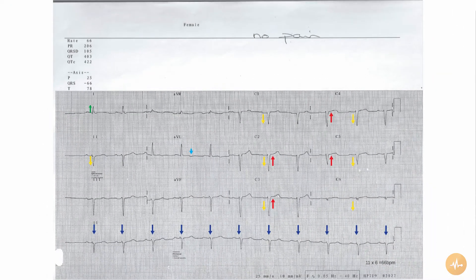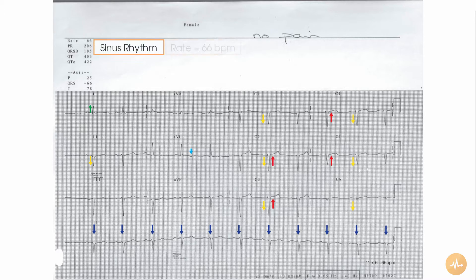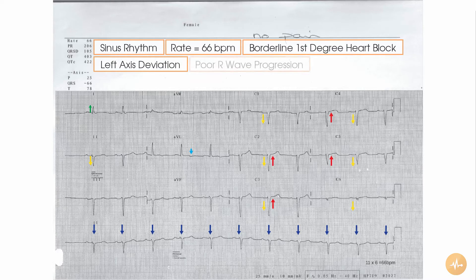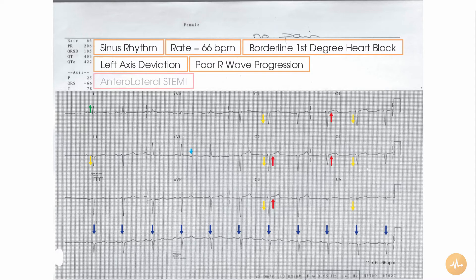In summary, this 12-lead ECG recorded in the absence of chest pain reveals normal sinus rhythm at 66 beats per minute with borderline 1st degree heart block, left axis deviation, poor R wave progression, and subtle ST segment elevation in the anterolateral leads.